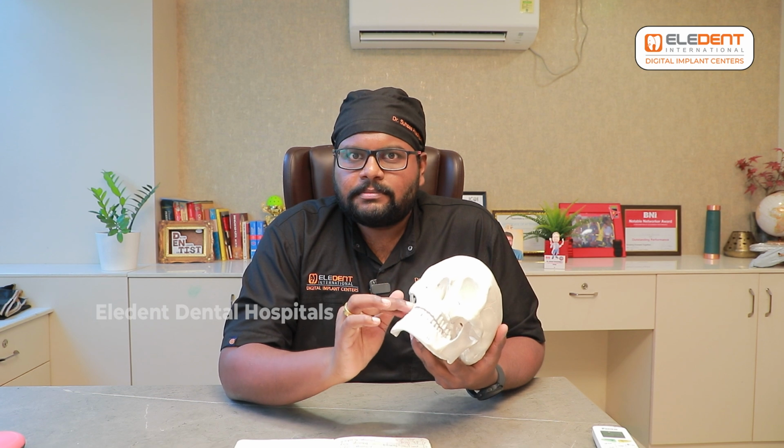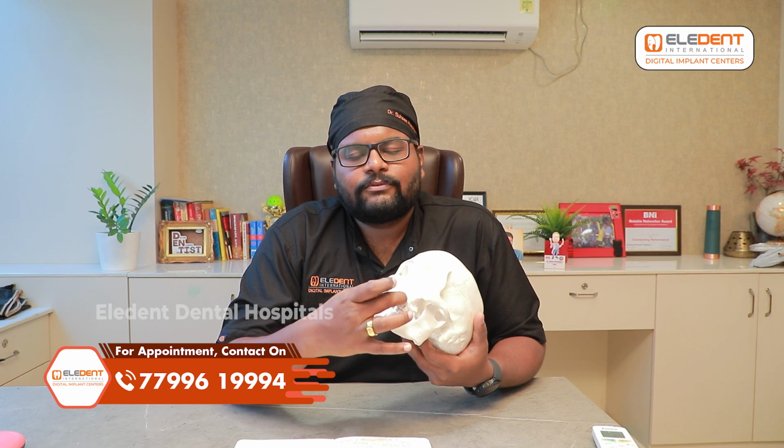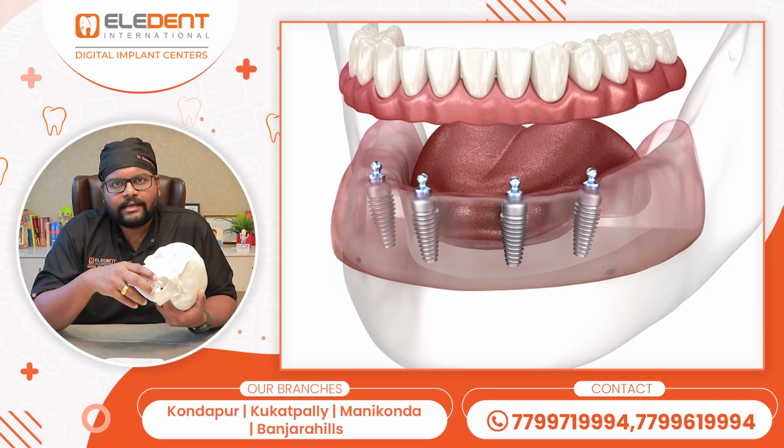This is only possible when all the teeth are missing, and we totally avoid placing the implant in the back side. We place 4 implants in the front and we give a denture which is semi fixed. We can click the denture into place over the implant, which will make it fixed, and we can also remove it by just pulling it down and separating the button.